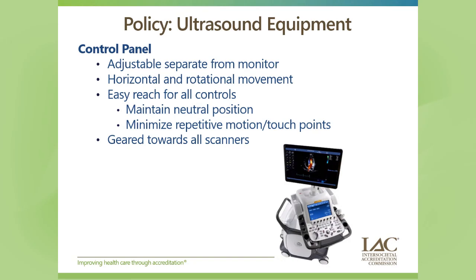And then also thinking about minimizing those repetitive movements. That's another big thing with our ergonomics policies and those touch points. But ensuring it works for all of your workforce as far as the ease of use and appropriate height and mobility.